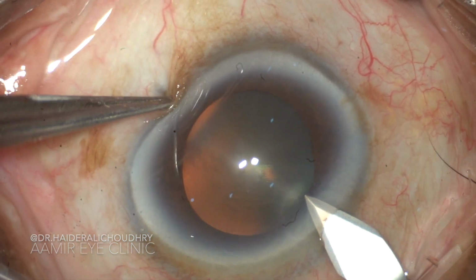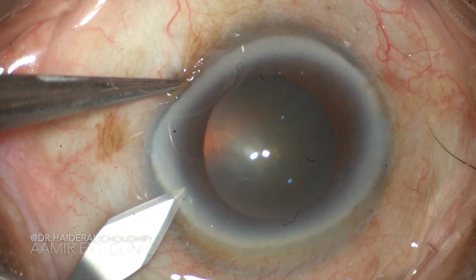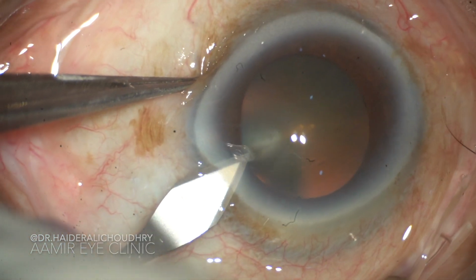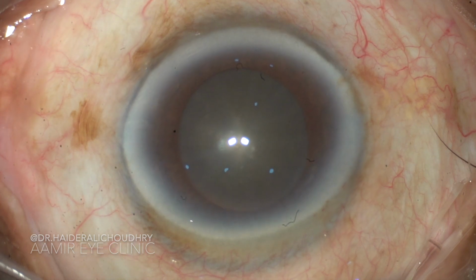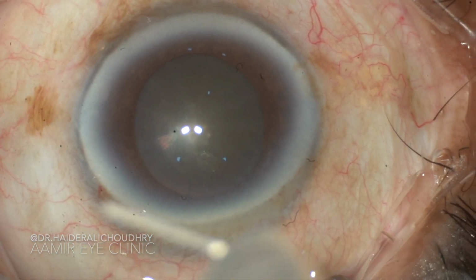This is a case of cataract in a 52-year-old man. This patient also has a very thick arcus. So we are performing the phacoemulsification with foldable IOL implantation.